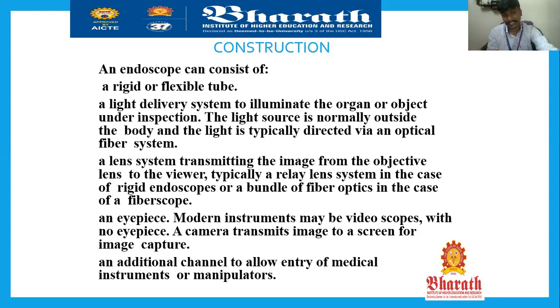After the recent advancement and development in technology, a VGA camera or 2 to 5 megapixel cameras are placed and inserted into the human body, and they are non-toxic and don't have any matching problem with the immune system.